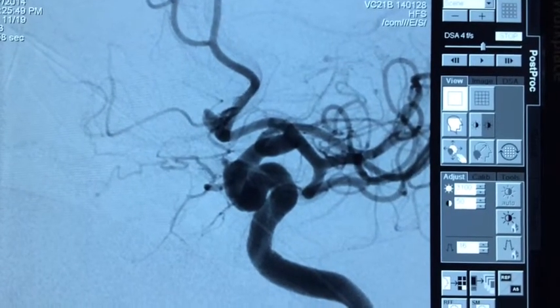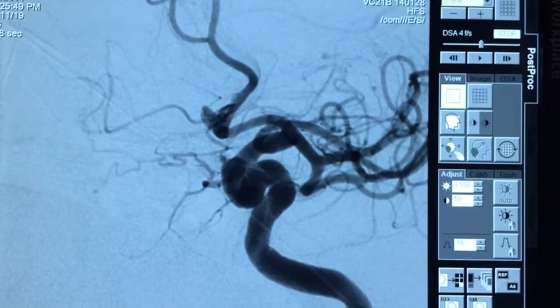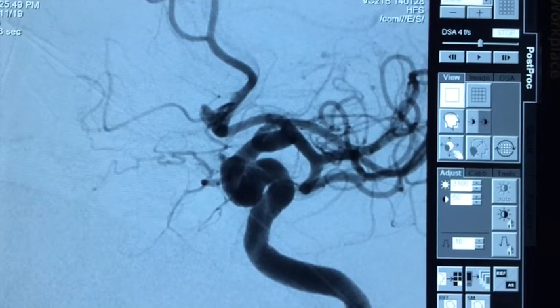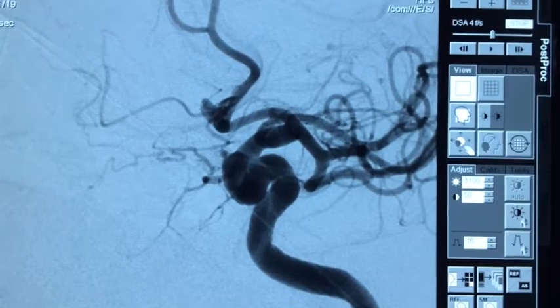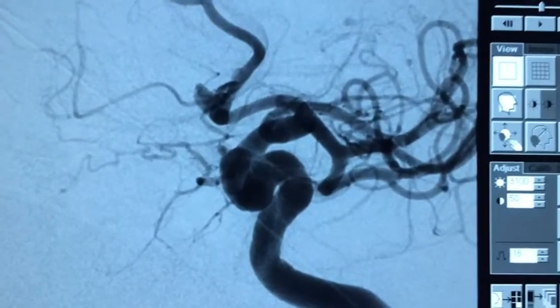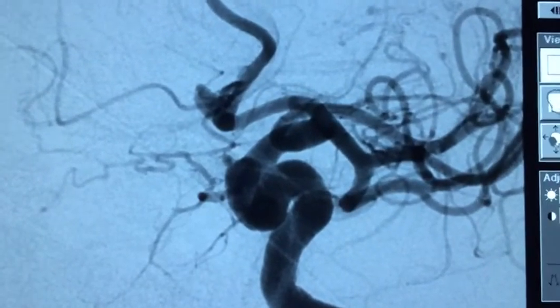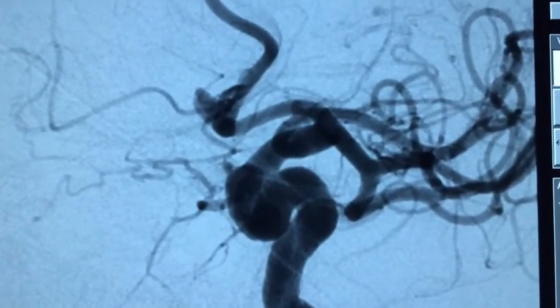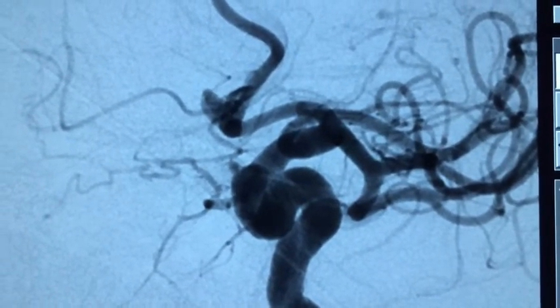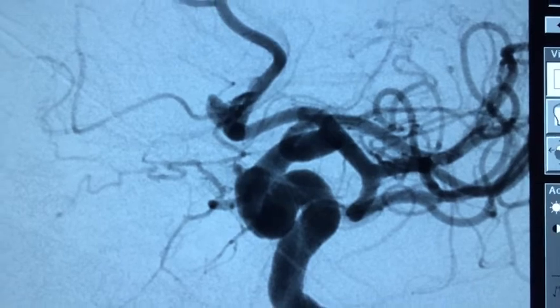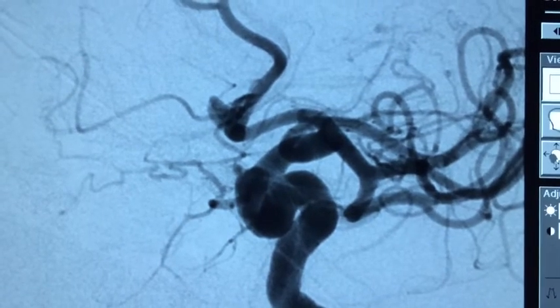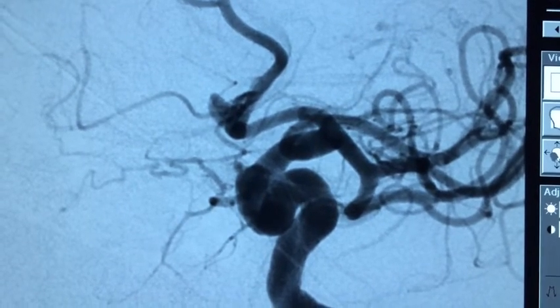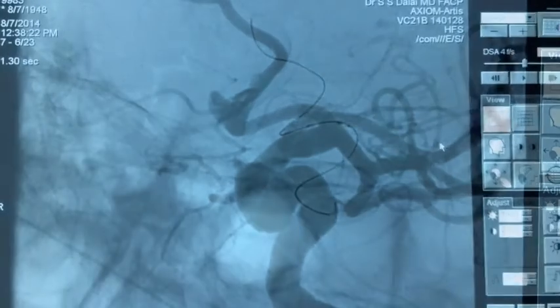The angiogram demonstrates the ruptured anterior communicating artery aneurysm. Specifically, this is opacified from the left internal carotid artery, and the aneurysm is pointing upward and anteriorly.